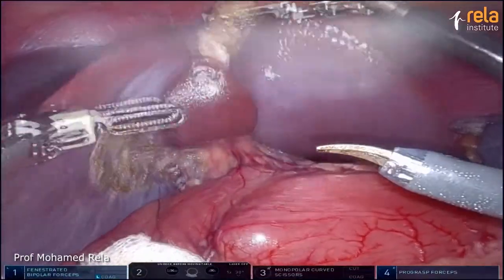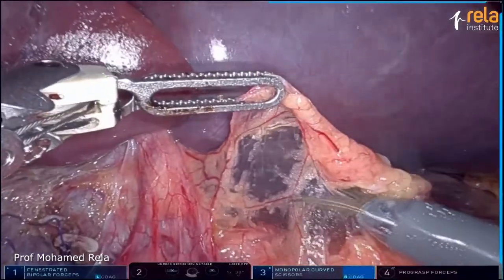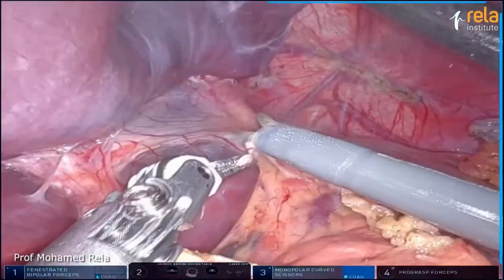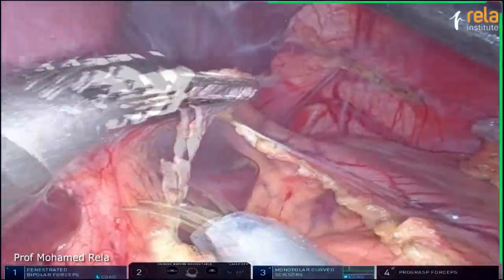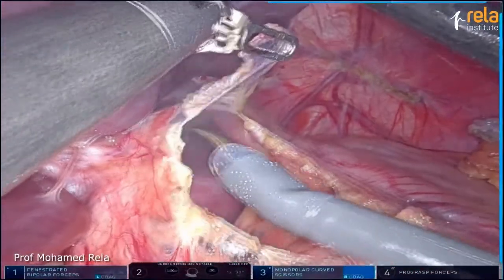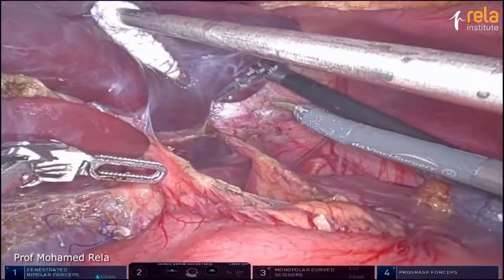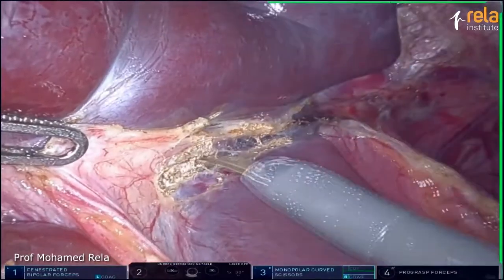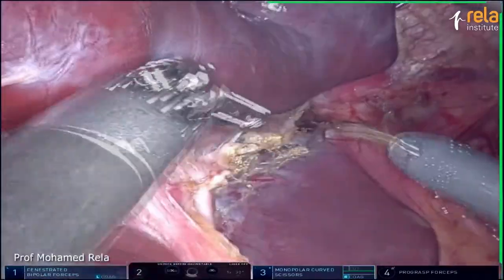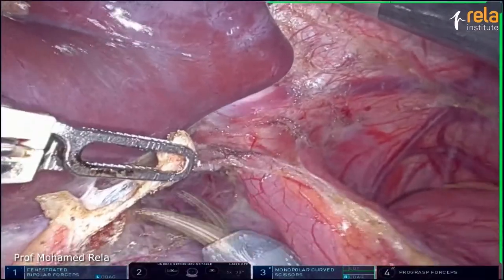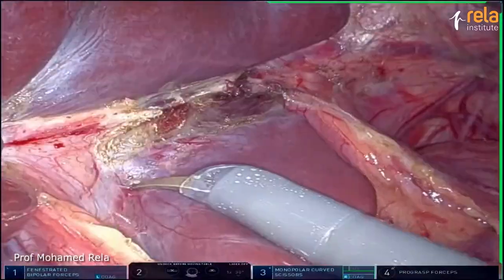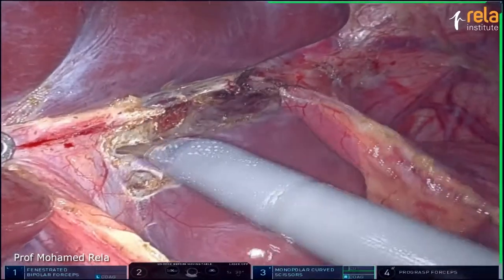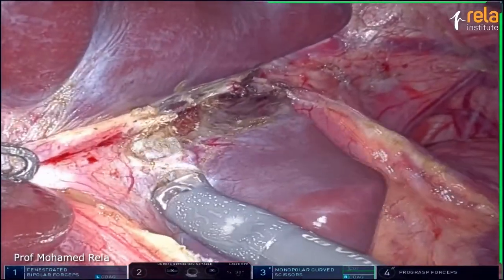This is the hilum. I'm excising a little bit of the lesser omentum and reaching to the back of the left lateral segment — the plane between the left lateral segment and the caudate. You might find some portal branches to the caudate here, or even some arterial branches from the left hepatic artery to the caudate. I'm isolating one of the portal branches and separating it. I'm not dividing it now; I'll do it later.